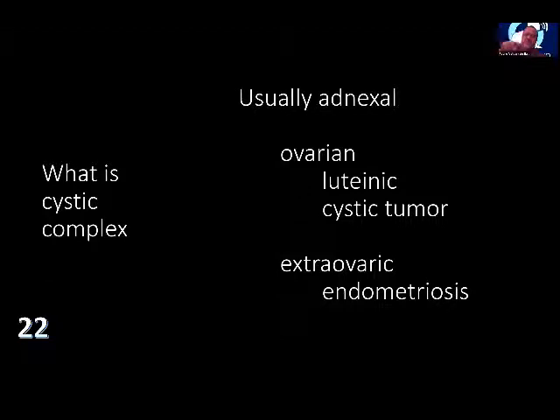So sometimes ovarian cystic complex things are functional, like luteinic cysts, or non-functional neoplastic, like a cystic tumor. We have to interrogate the patient and make our best clinical judgment in order to have a diagnostic impression to suggest to the referral physician.